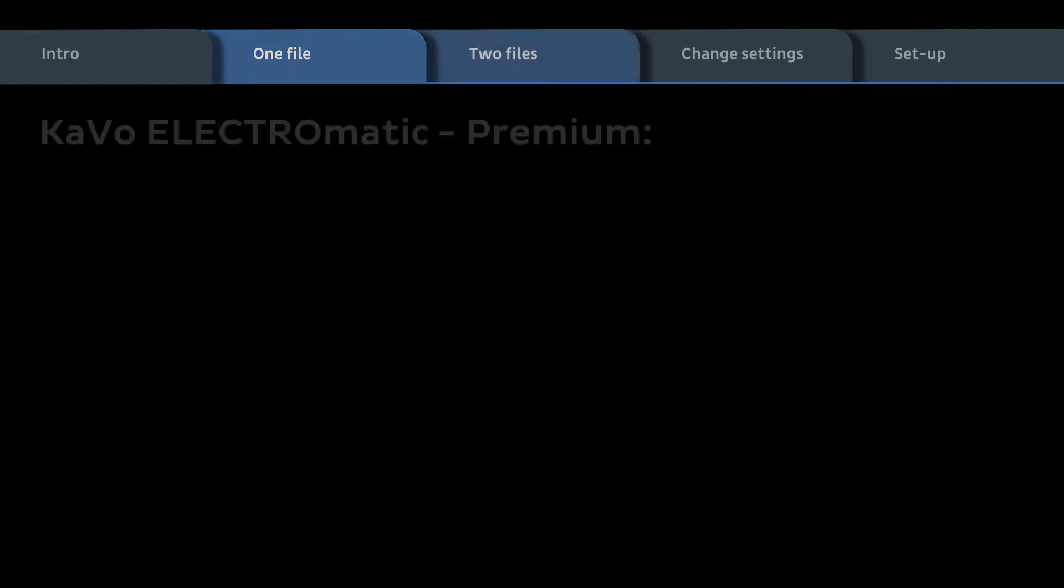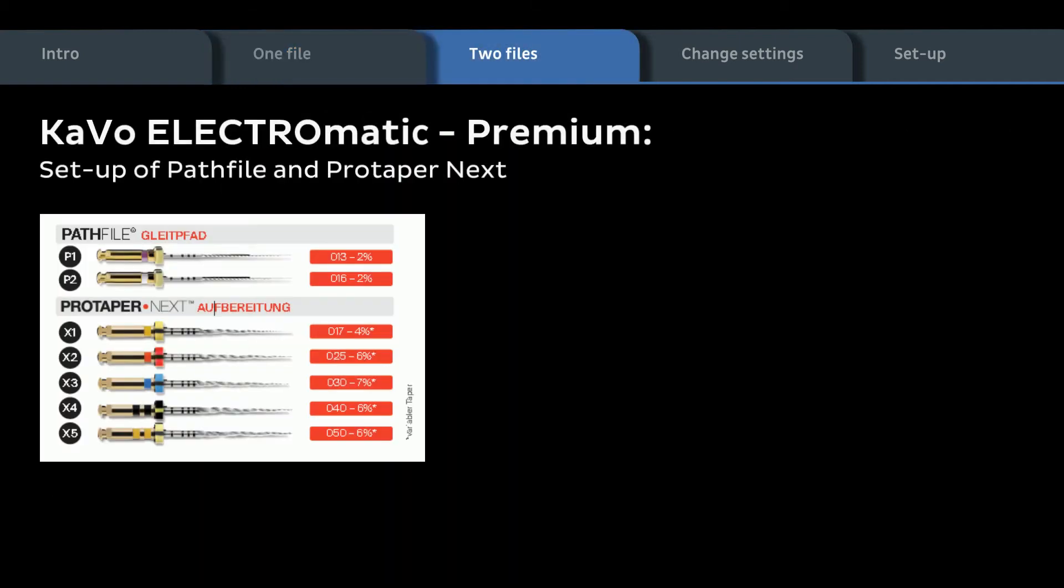Let's now program a second sequence with two different file systems, the PathFile and the ProTaper Next. Two file systems within one workflow.